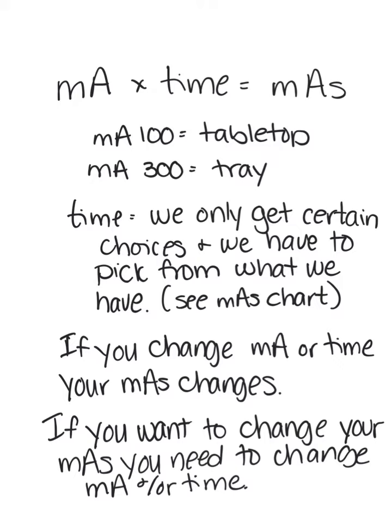Now in reality, when you go to the machine, you're only going to be changing one dial, but two things on the machine will change because mA times time equals mAs. So that's the first thing to remember.